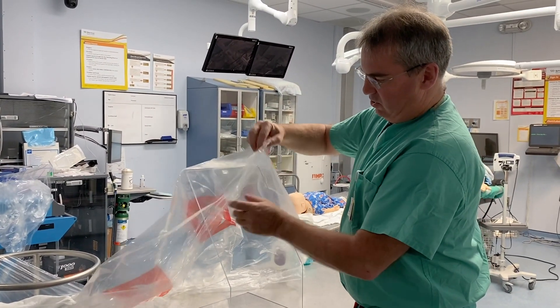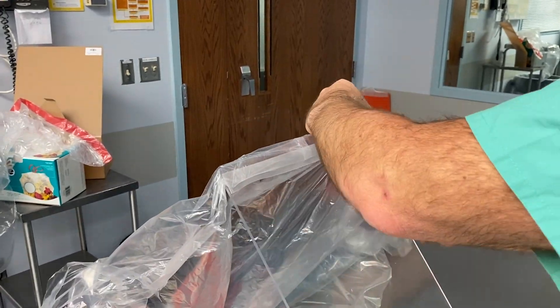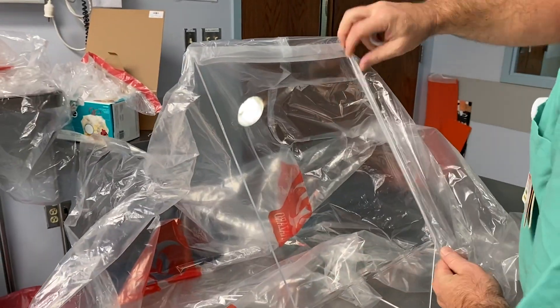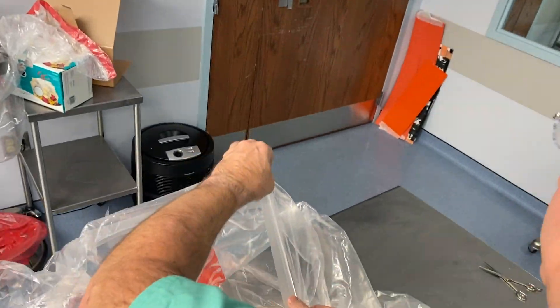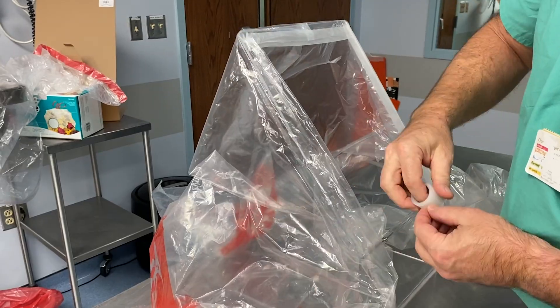This is the bottom of the bag. This is the seam that I opened up to be the side of the bag. I'm then going to take that bottom of the bag and seal the inside of the bag. I'm now creating a tent where I can work.